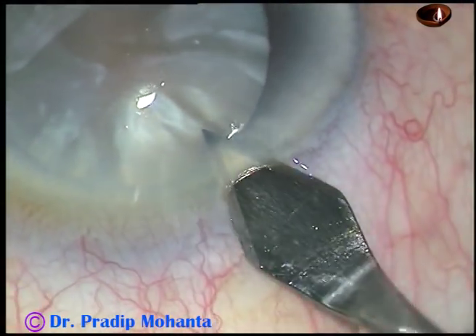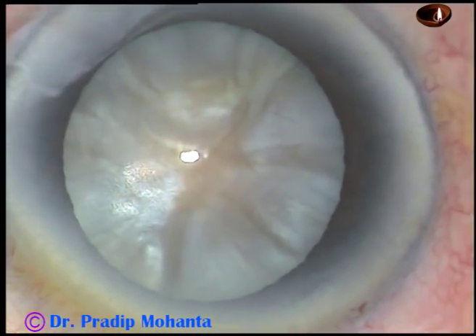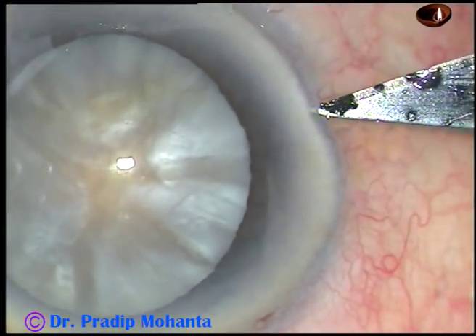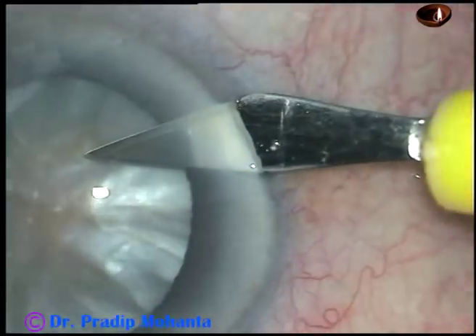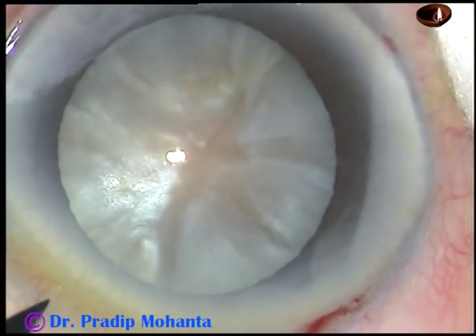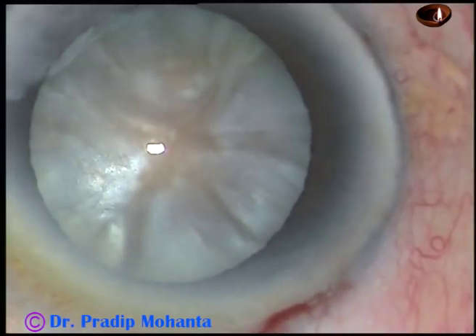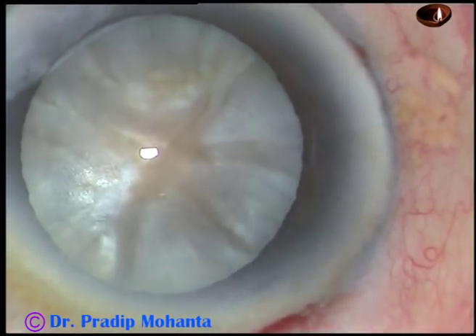This is the main incision at a selected site. This is a 2.8 mm incision on the posterior aspect of the limbus. This is a side port on the right side of the main incision about 3 clock-hours away, and this is another side port on the left side of the main incision about 2.5 clock-hours away.